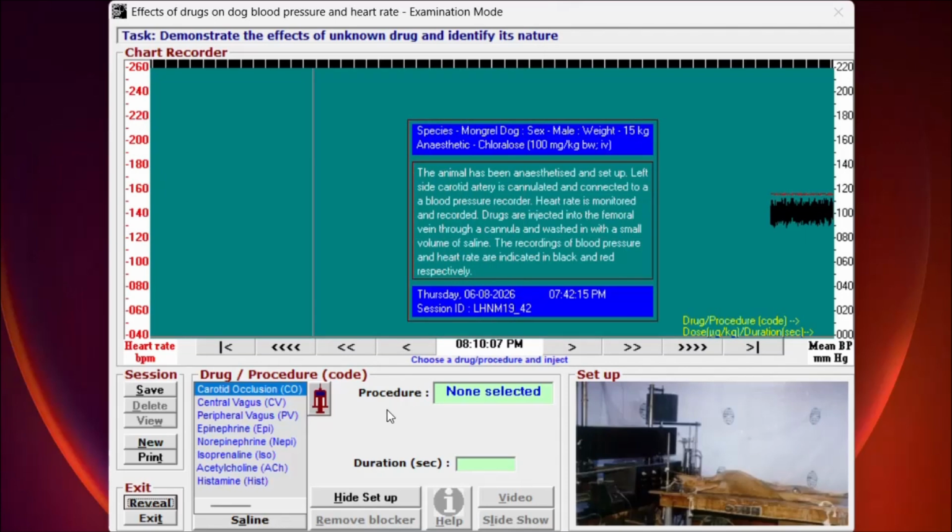It will not have any explanation. You will just be able to note down the steps for how to perform the particular experiment. Though I have already explained that in detail, here you will get the live demonstration.